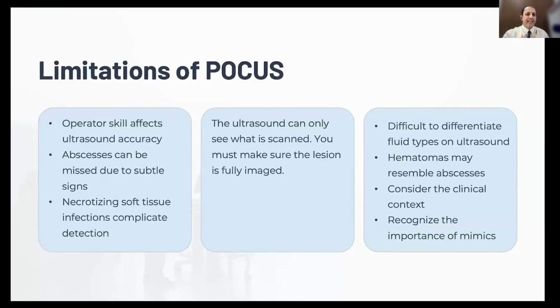That's why you need to practice and review your images with someone more expert than you, and even with the radiologists, the images they will send for us. I'm always reviewing what I found in my case and what they are reporting and what they detected. In this way, maybe we can learn much better. And we can miss very subtle cases also, very early stage of abscess formation.